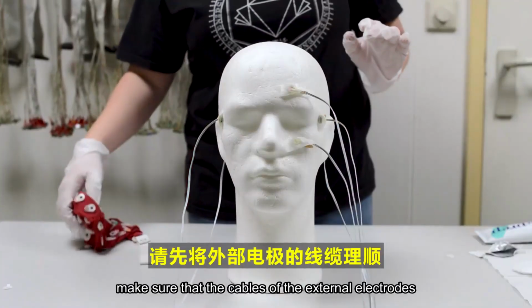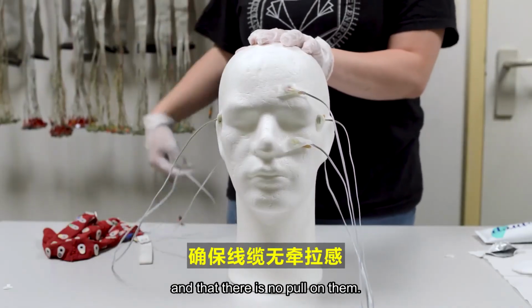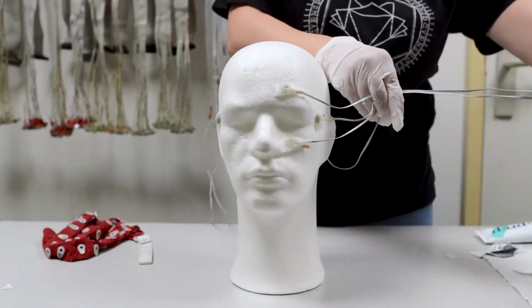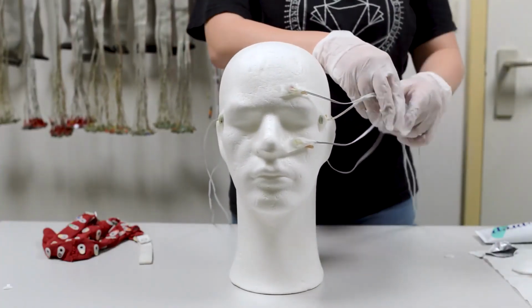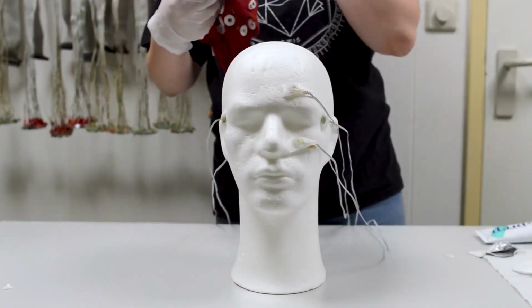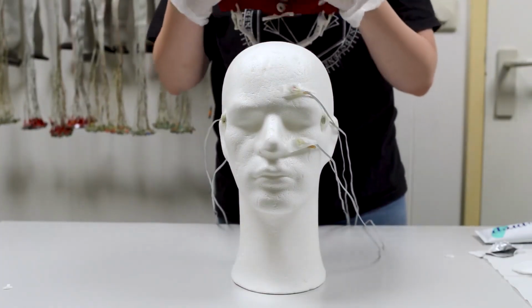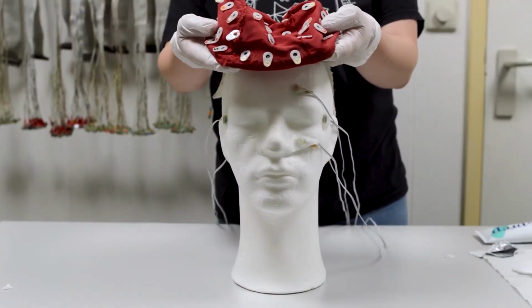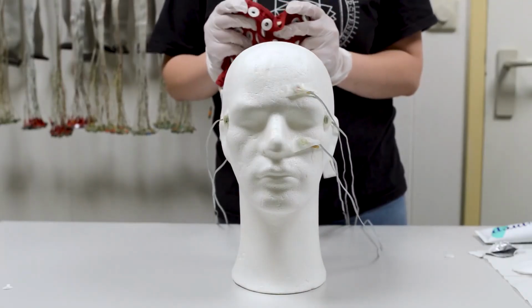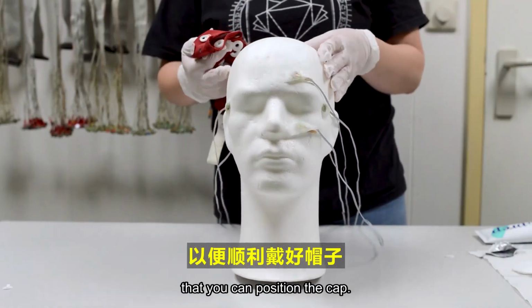Before putting the cap on, make sure that the cables of the external electrodes are comfortably tucked behind the participant's ears and that there is no pull on them. The cap must be put on the head from above, so you can ask the participant to hold the front of the cap while you put it on. If the participant is very tall, you may also ask them to put their head back a little bit so that you can position the cap.